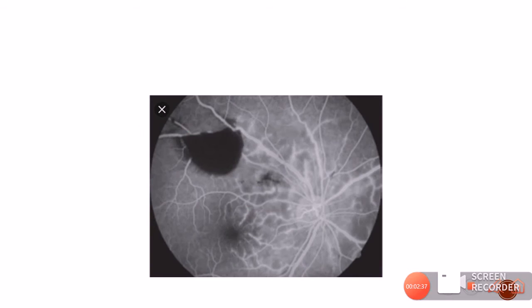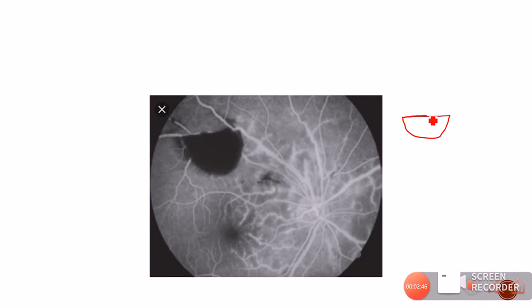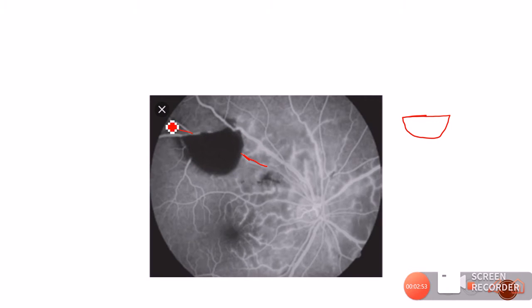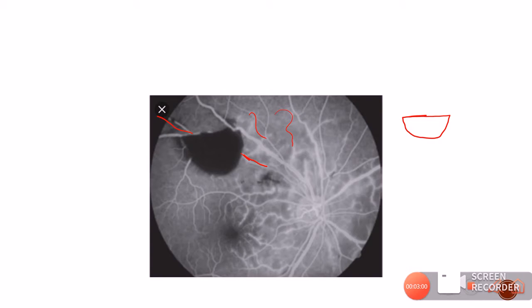This is an example of a pre-retinal hemorrhage. As mentioned in the video on vitreous hemorrhages, pre-retinal hemorrhages are usually boat-shaped. We can see this pre-retinal hemorrhage and we cannot see any retinal vessels in that area, nor can we see the background choroidal fluorescence — confirming this is a pre-retinal hemorrhage blocking both the retinal and choroidal fluorescence.